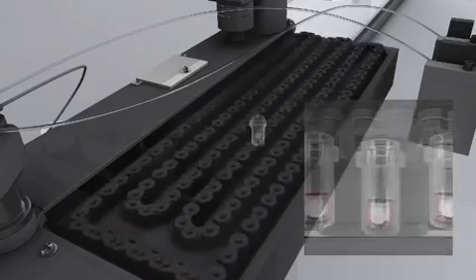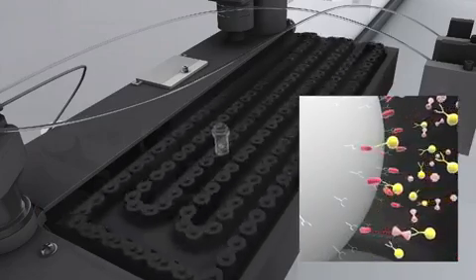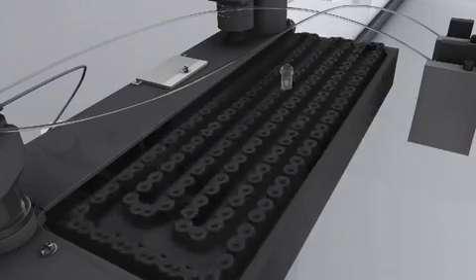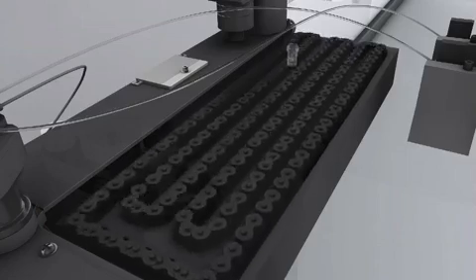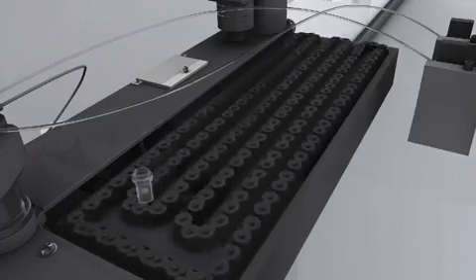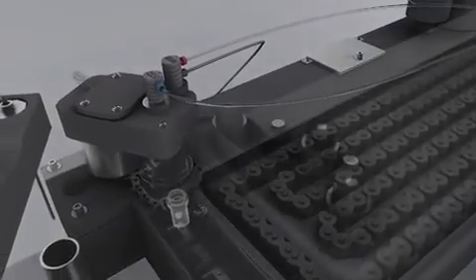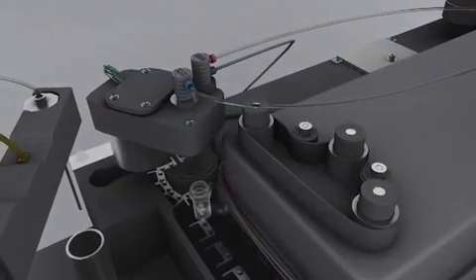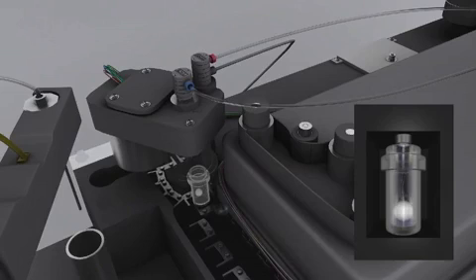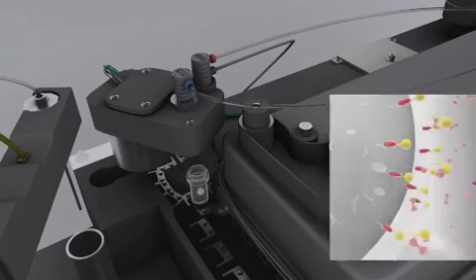The incubation period varies and is dependent on the assay. If a second reagent is needed, it can be pipetted into the tube following incubation. Otherwise, when the incubation is complete, the tube will enter the wash station. Within the wash station, the tube is spun on its vertical axis. 400 microliters of water is dispensed onto the bead, and the bead is spun again. This wash cycle is performed a total of 4 times.